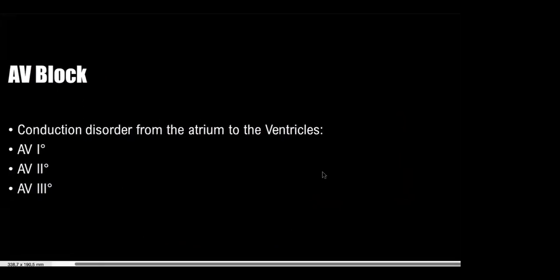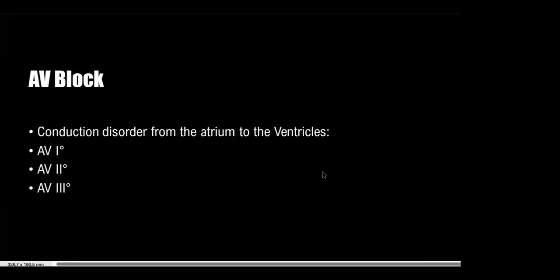So when we talk about the AV block, or atrioventricular block, we have 3 types, some mild and some dangerous. We have the 1st degree AV block, we have the 2nd degree, and we have the 3rd degree. Next slide.